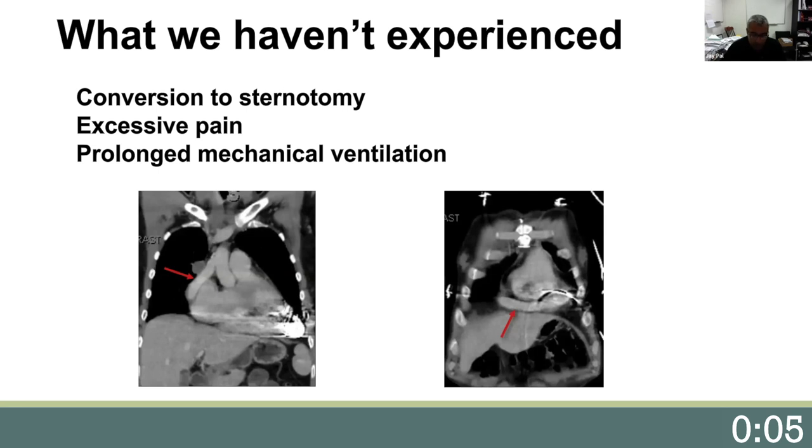In addition, the incisions are well suited to intercostal blocks, especially if a bithoracotomy approach is used, so pain control is superior to a sternotomy. And since the incisions are anterior, they do not interfere with the respiratory mechanics as a posterolateral thoracotomy can, and even patients with marginal lung function tolerate the procedure well. Positioning the outflow graft along the diaphragm and right side of the heart is straightforward from the thoracotomy approach.